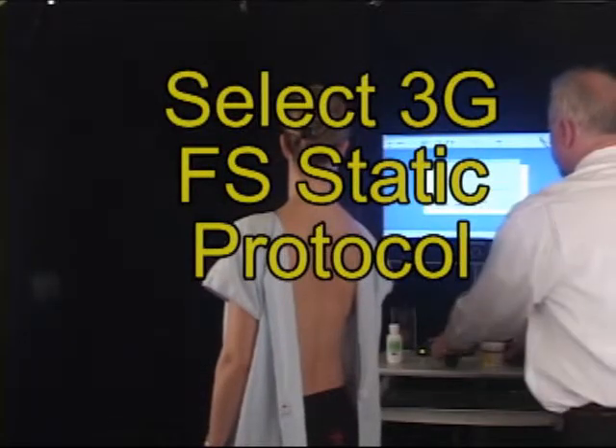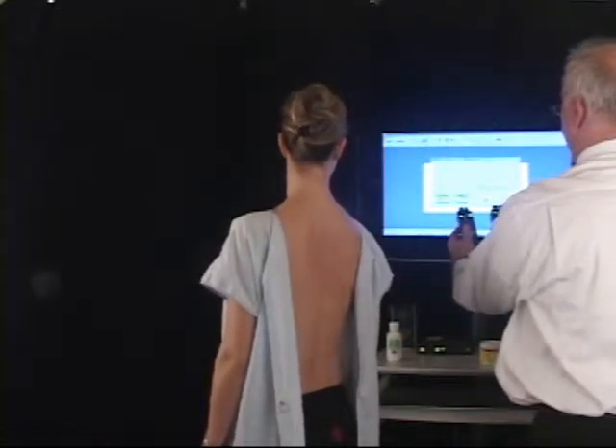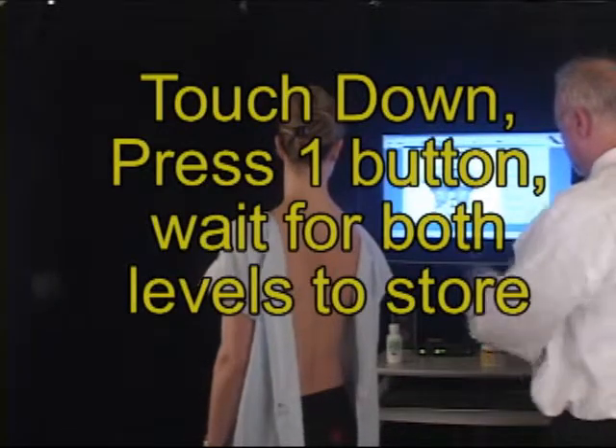Then you simply press another button to continue on to perform the test. We're selecting this, again using both buttons to turn it on, and then one button to actually move forward into performing the test.